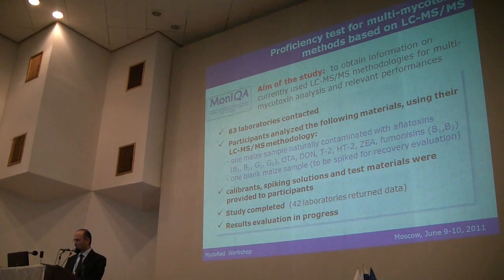In addition, we provided calibrant spiking solution and test material to analyze. The study has recently been completed, but results are under evaluation.